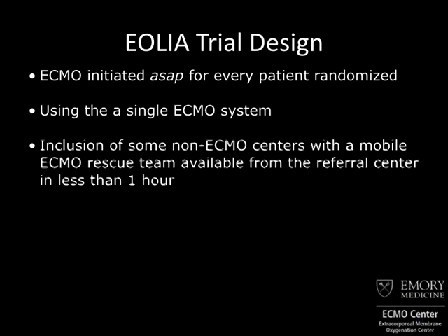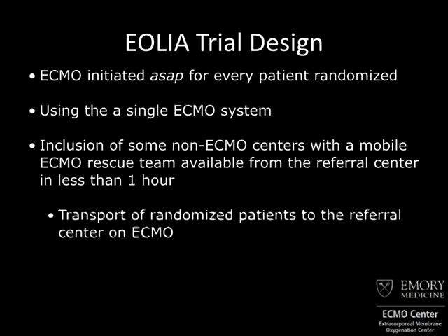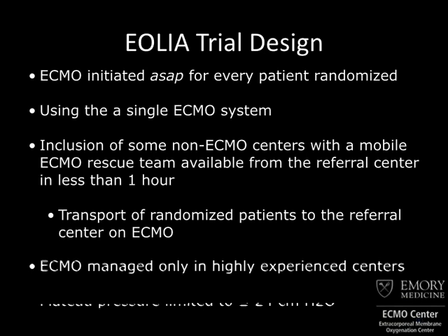They have the ability to send mobile teams to centers, and they can get to those centers in 1 hour with a cannulation team. And they will transport those patients on ECMO to an experienced center. And so they are not going to have the transport deaths, and they aren't going to have the enrollment deaths that we're seeing in CESAR in all likelihood.